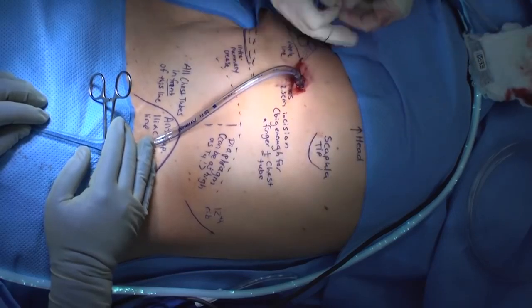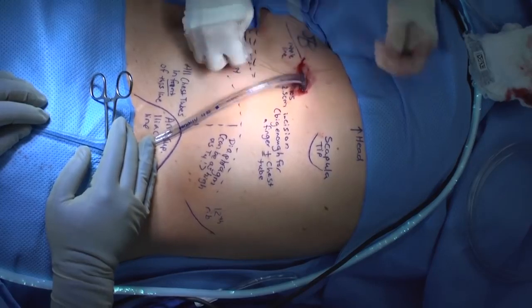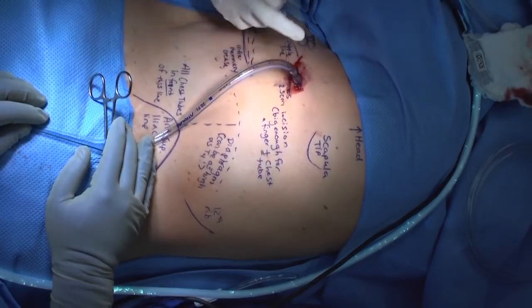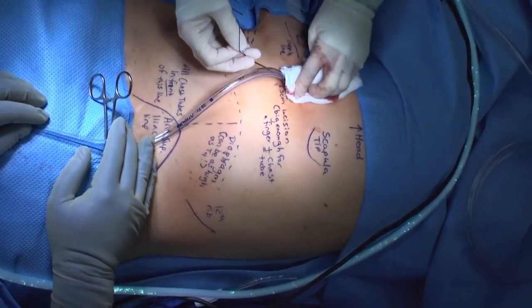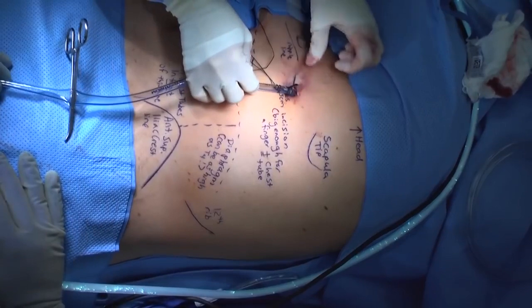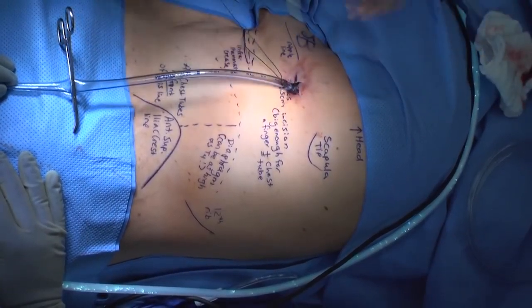We use a second suture to close incisions if there's an additional space, because you want to avoid any extrusion of fluid or the introduction of air. Always bring an extra stitch just in case you need it. Connect your chest tube to your atrium and band it to ensure that it does not become disconnected accidentally.